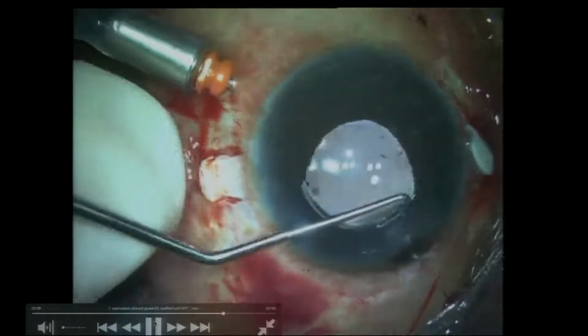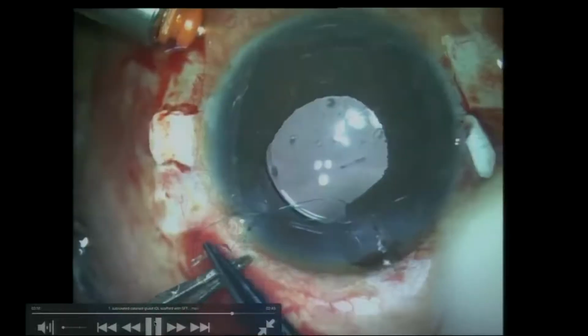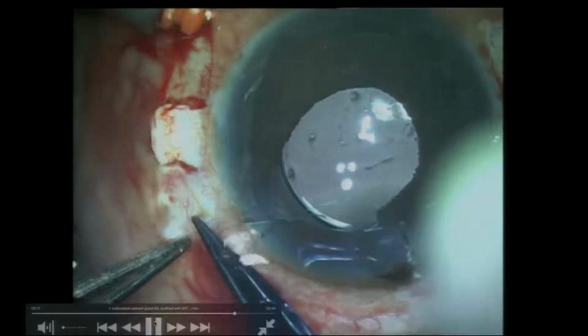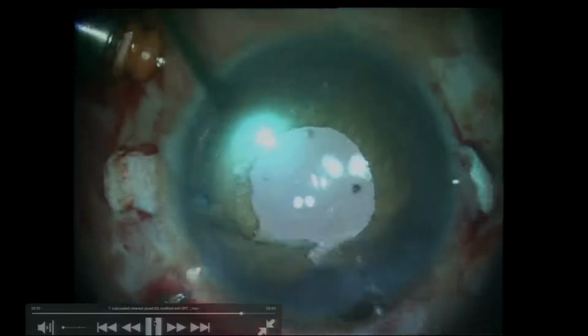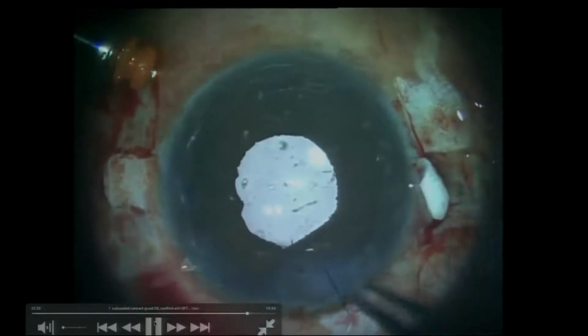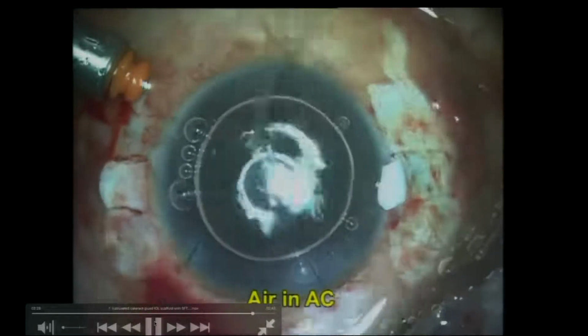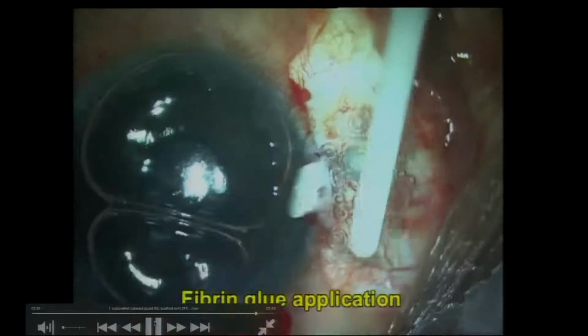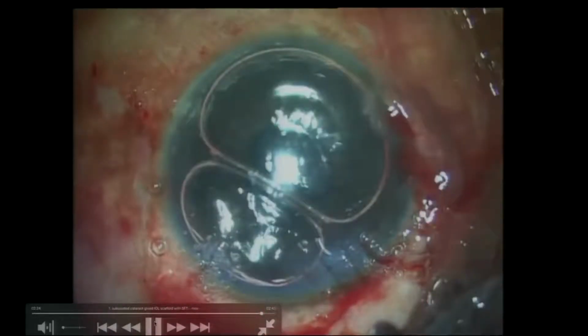Here is where I was talking about the pupilloplasty, and my choice of pupilloplasty is a single pass four-throw. If you can see here, I'm bringing out one loop like a modified Siepser, and now passing it 4 times, and just one throw, 4 times, loop and closed. That's pretty much it. I don't even go the second time, third time, because that causes more trauma to the iris, that causes more uveitis the next day and more inflammation. So that's something that we don't try and do.